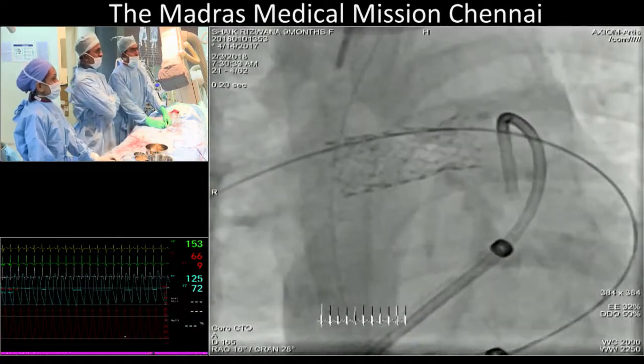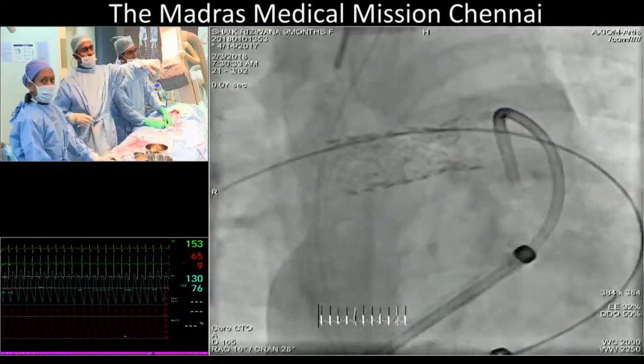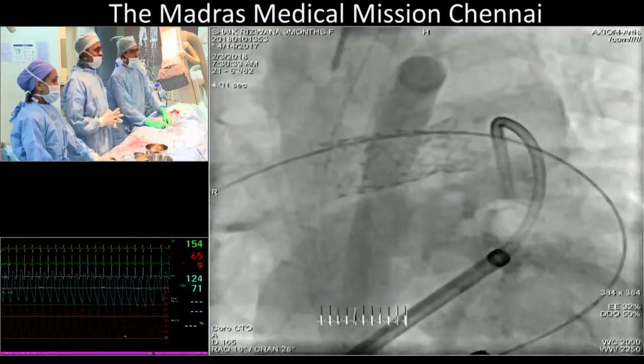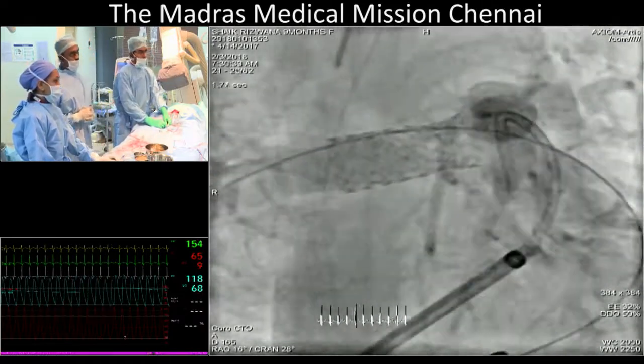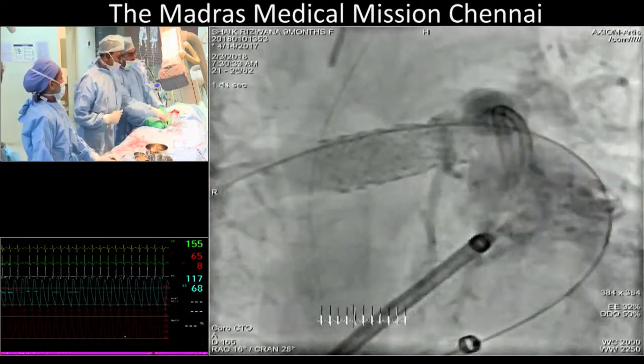Are you able to see the pressure also, Shaq? Yes. But can you change the red into yellow? I think red is not visible. Okay, fine. No, yeah, we see it though. Okay, so right now go back to the left. We will see the left how it is.